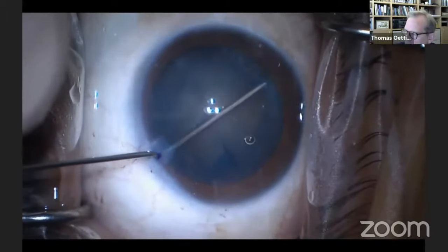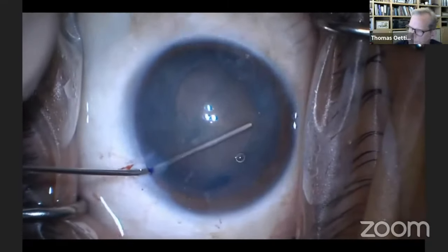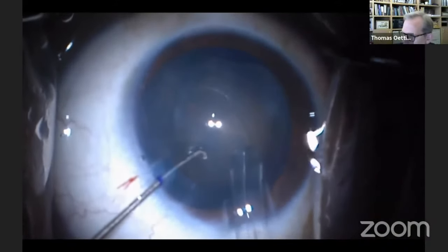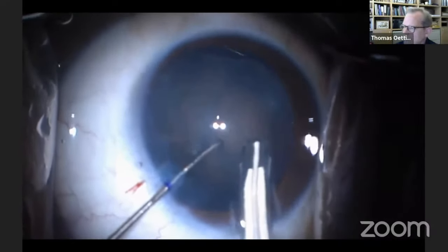And so one of the things you're going to notice is trypan blue snuck around there and ended up ruining our red reflex, because trypan blue got through that stain because we didn't use that initial viscoelastic for protection. So you can see we have a very poor red reflex here because we've had trypan blue, which has gone around. But here we're placing an earlier capsular tension ring. We're using that Sinskey technique. And you'll see that the lens is actually reformed a bit.